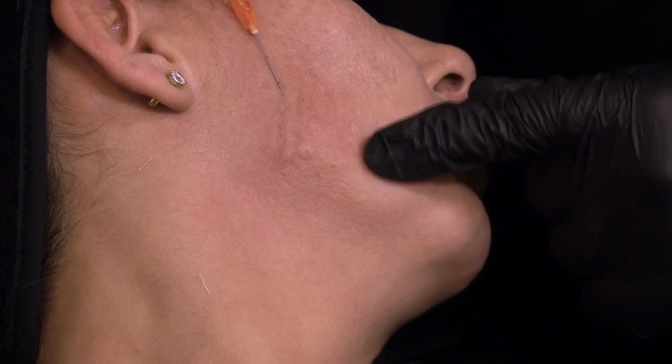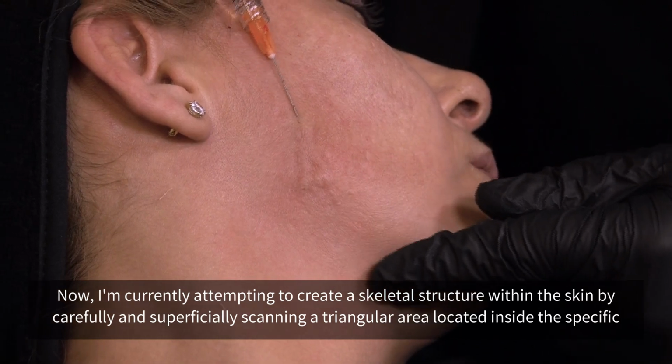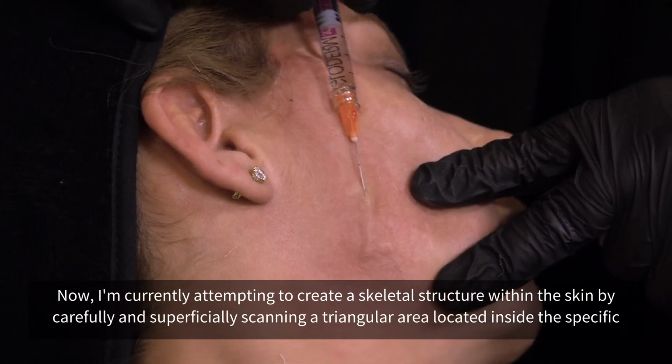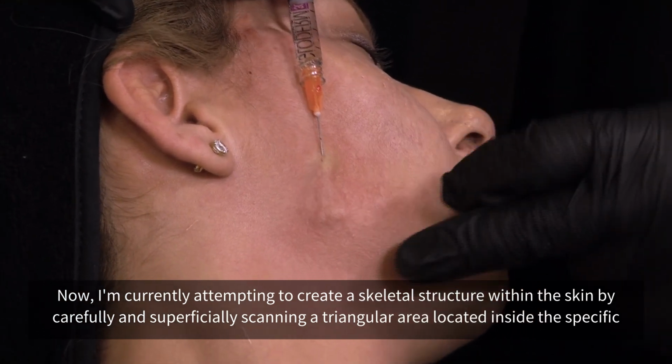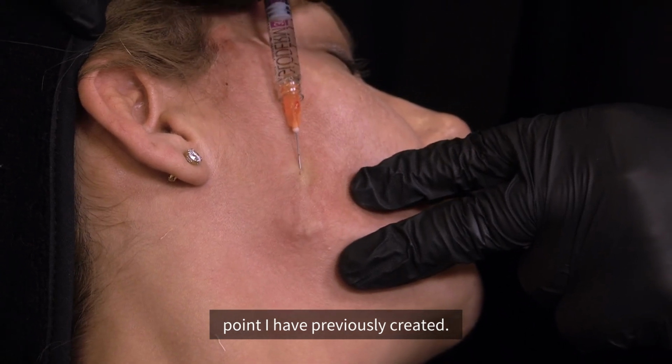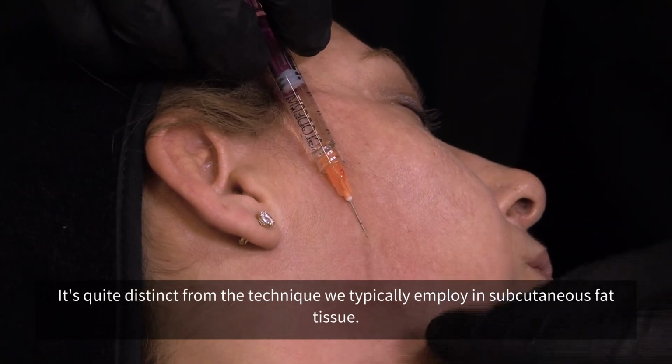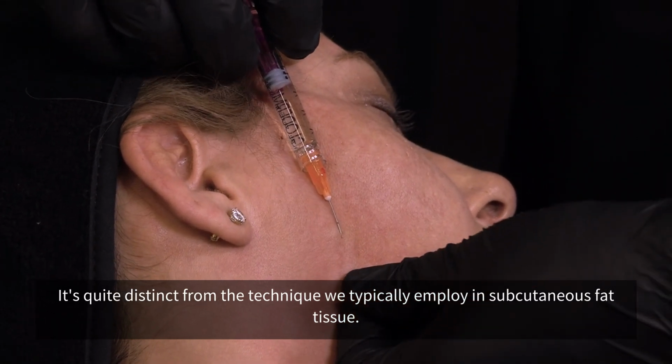in place. Now, I'm currently attempting to create a skeletal structure within the skin by carefully and superficially scanning a triangular area located inside the specific point I have previously created. This technique is quite unique. It's quite distinct from the technique we typically employ in subcutaneous fat tissue.